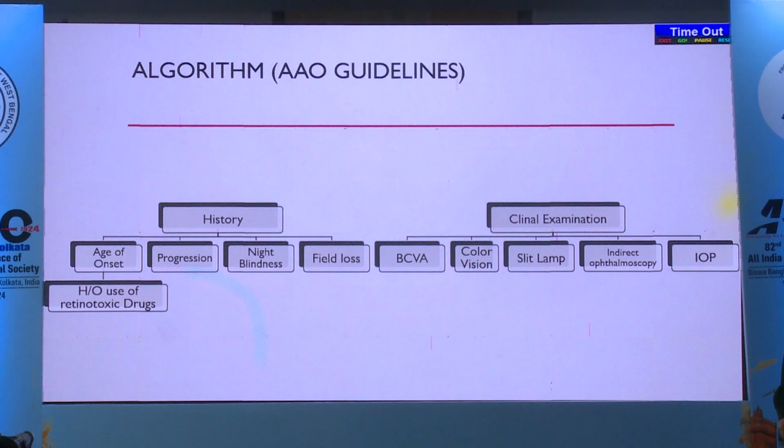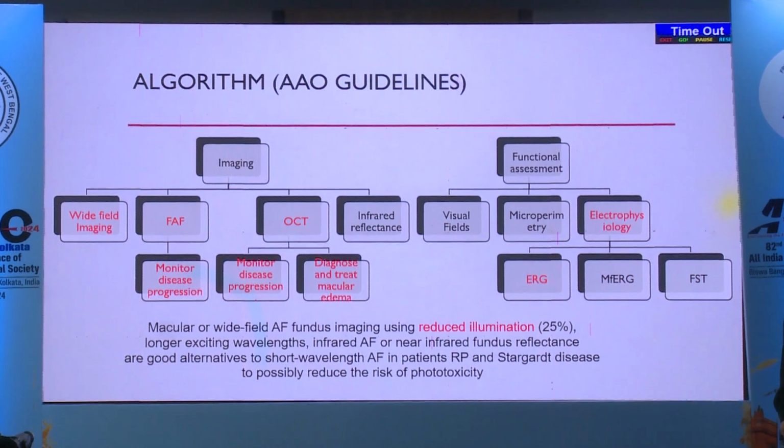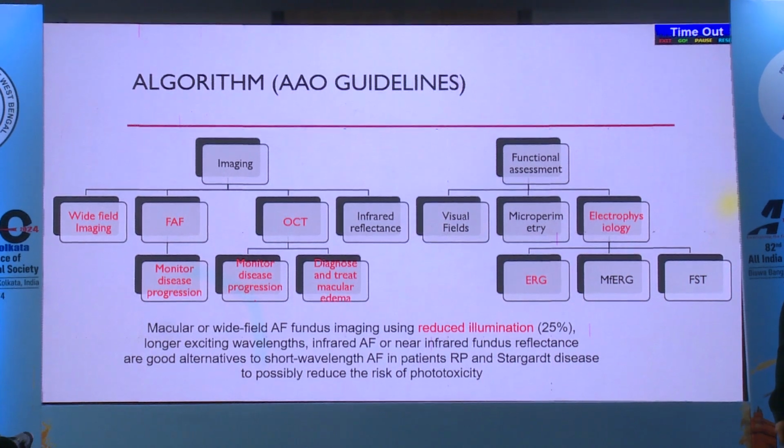Coming to the algorithm. The patient comes to you in the clinic. I think from my talk, now you should be clear with the algorithm. You take the history, you do a detailed clinical examination, and then multimodal imaging, functional assessment, wide field imaging, FAF, OCT. These will help you diagnose, and help you know the prognosis and the progression.